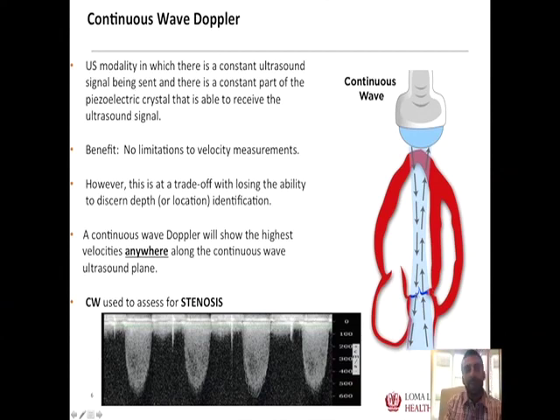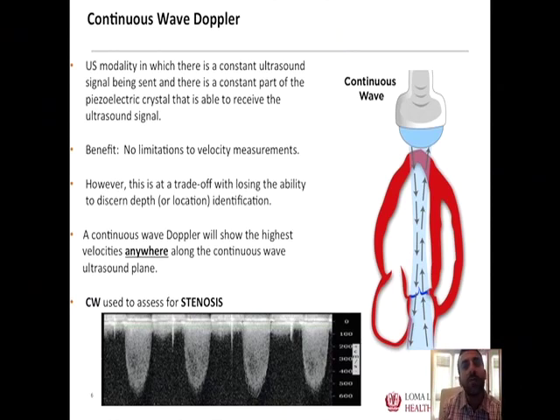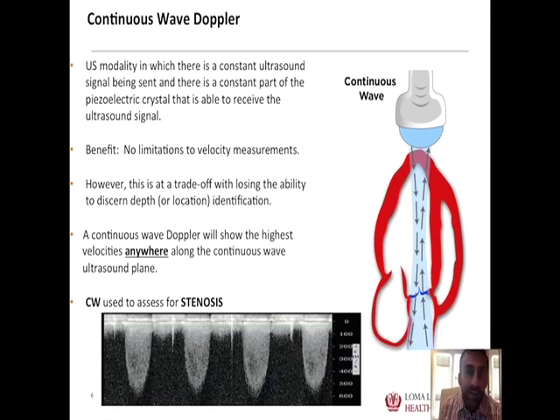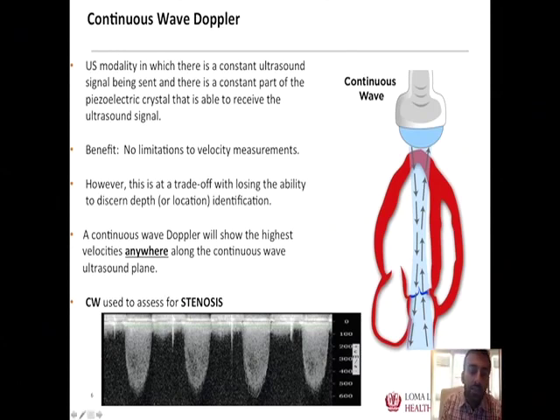We do a 2D cardiac ultrasound exam, visualize an aortic valve that looks calcified with impaired movement, use Doppler to look for flow acceleration, and put the two together to identify that this person has aortic stenosis.